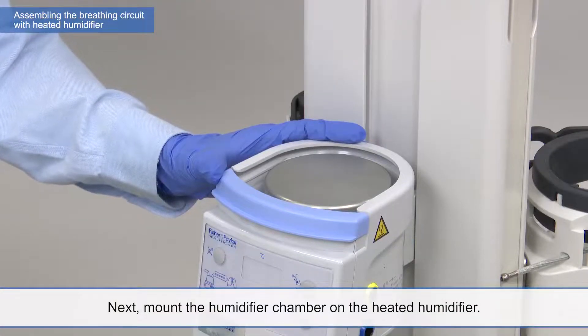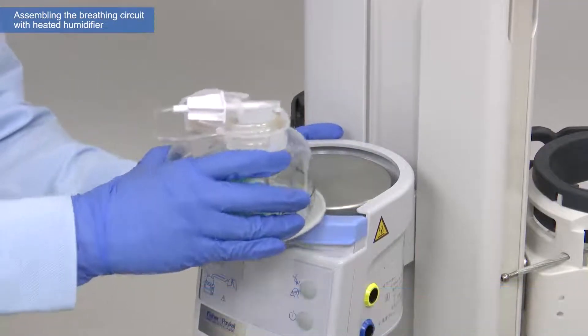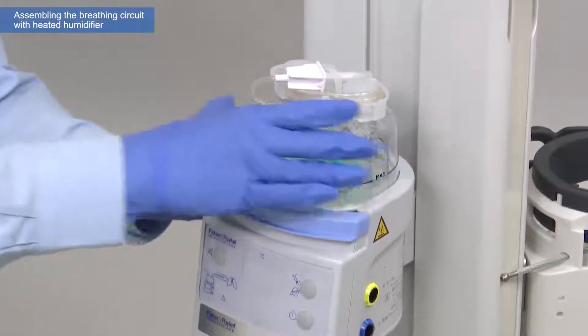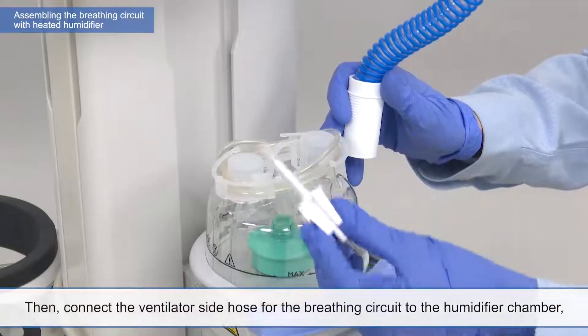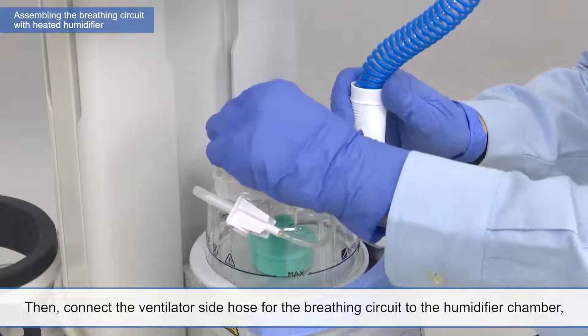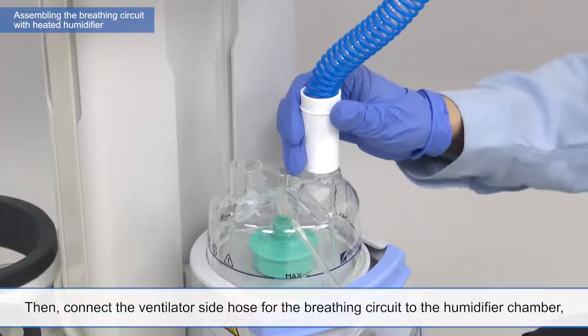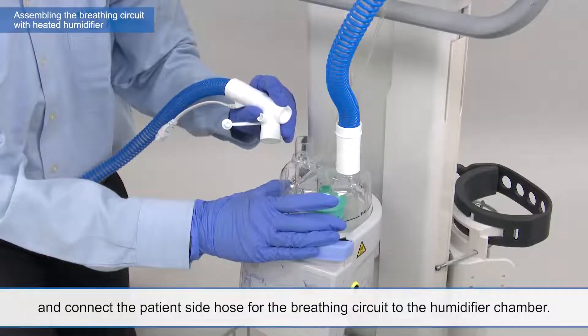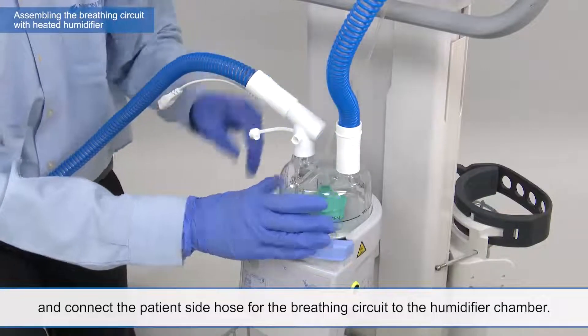Next, mount the humidifier chamber on the heated humidifier. Then, connect the ventilator side hose for the breathing circuit to the humidifier chamber. And connect the patient side hose for the breathing circuit to the humidifier chamber.